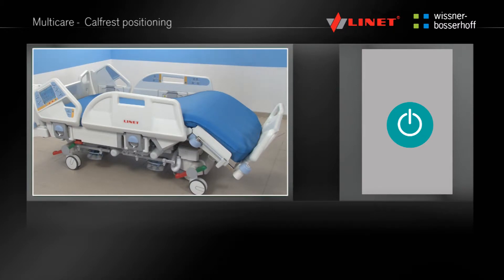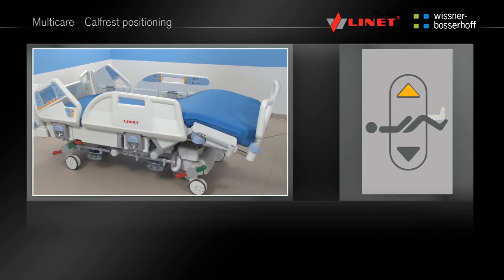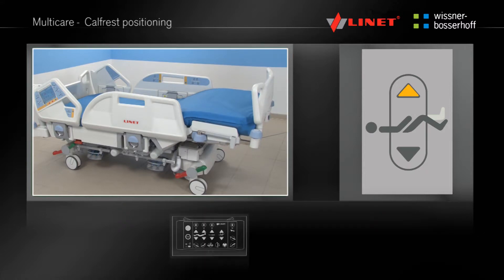Activate the function by pressing the Go button. Press and hold the function button until the desired angle of the thighrest or backrest is reached. This function is located on the integrated side rail controls and the Supervisor panel.